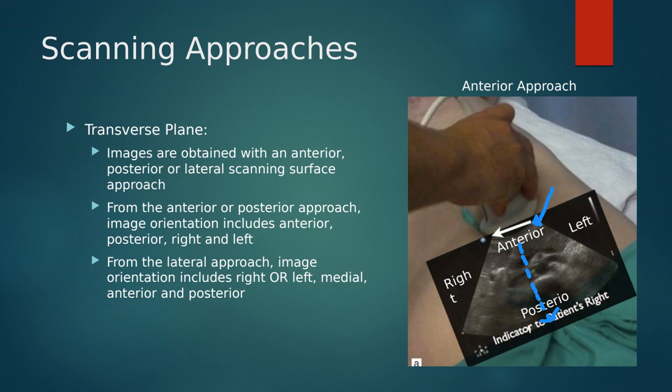And down at the bottom of our picture, we're going to see the patient's spine. And that's going to be the same for sag, transverse, and coronal, okay? The further down our picture we go, the deeper into the body we go, the more posterior we go.